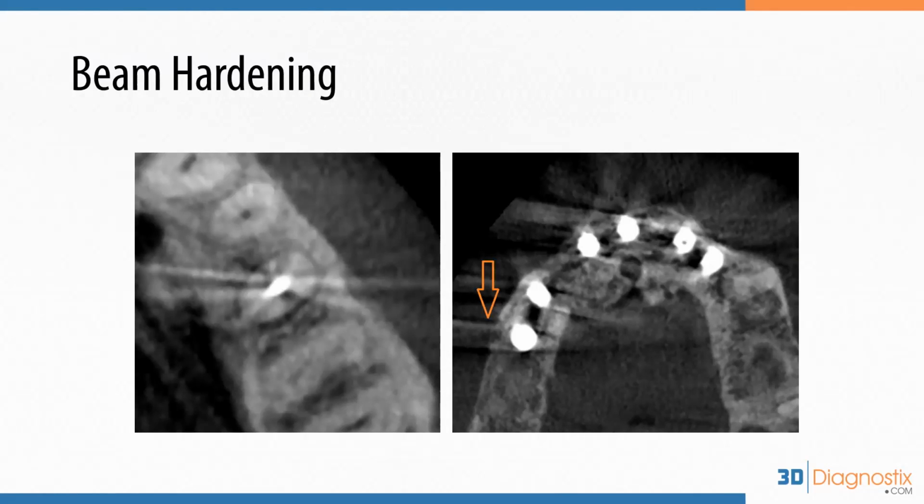So again, to minimize these artifacts, you need to make sure that the patient first does not move. Use head restraints, use the chin support, let them relax a bit and get accustomed to the seating position before you start scanning. As for the metal, you may have a protocol in your CT machine that can reduce the effect of the artifacts caused by metals, or if you do not, contact your provider and they may provide you with manual calibrations that could minimize the artifact in the CT scan.